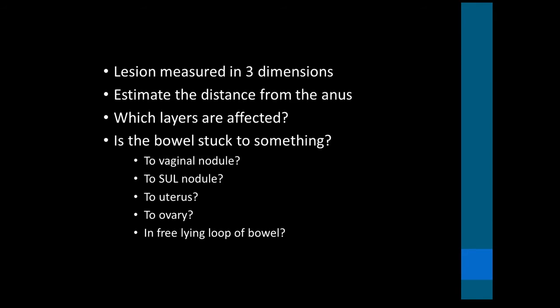But if we see a bowel lesion, it's important to measure it in 3 dimensions. When I do the systematic assessment of the bowel, I try and estimate the distance from the anus. Basically, I freeze the image, I measure, I then push the probe further and continue to measure bit by bit, just assessing how many centimeters there are before I get to the lesion.